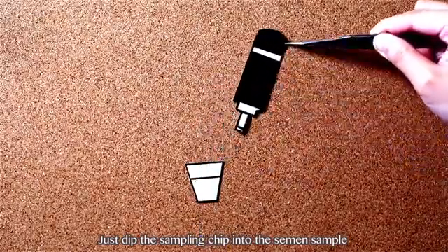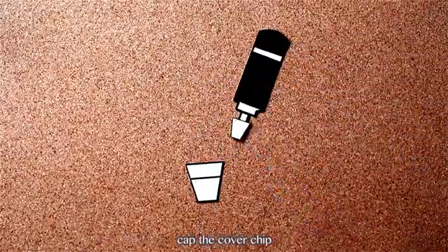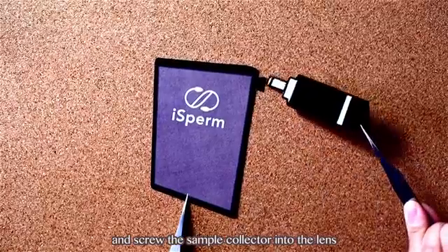Just dip the sampling chip into the semen sample, cap the cover chip, and screw the sample collector into the lens.